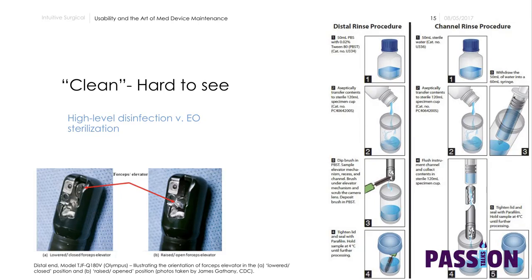It's very flexible, so you're limited to materials that probably can't undergo high temperature steam. And so that's the trade-off, where it has to go through this process called high-level disinfection. And actually, at a hospital, I believe in LA, it was a unique case where they were able to trace it back to the original patient where this very rare multi-drug resistant bacteria had spread. It was rare, and they were able to sequence and isolate it back to the original patient because it was such a rare multi-drug resistant thing.